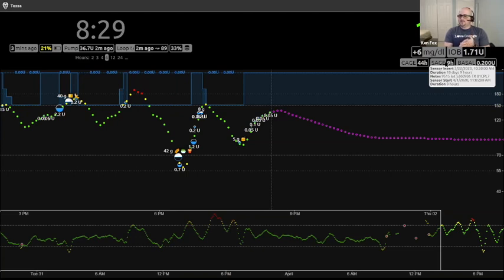You can look at the last prime on Medtronic. Which, if you've only done that when you're setting up a new one, you could use that as your cage timer. Thanks, Glenn. Activities. We'll talk about that in a second.